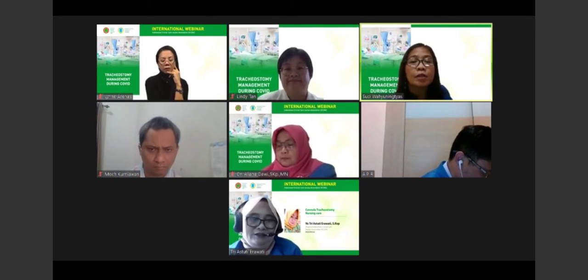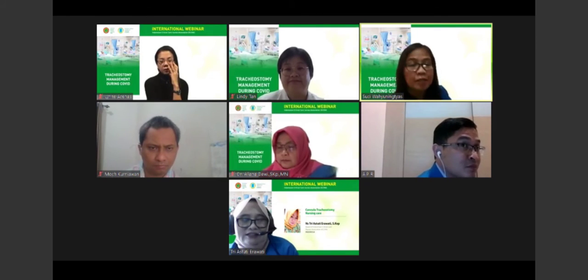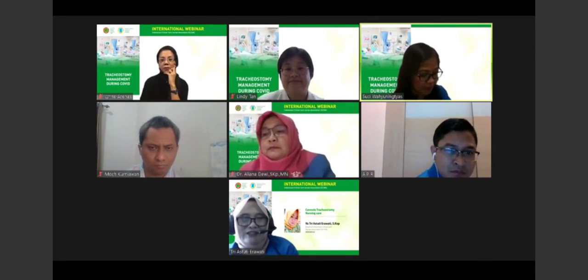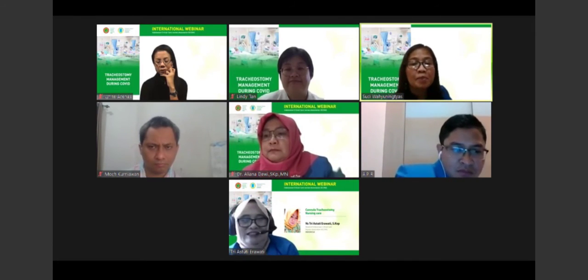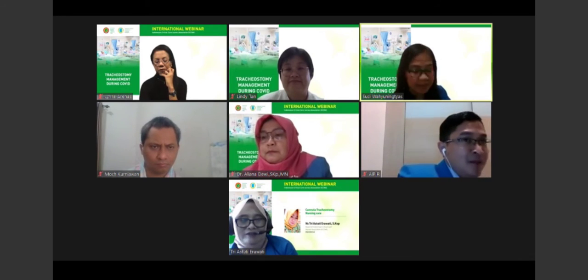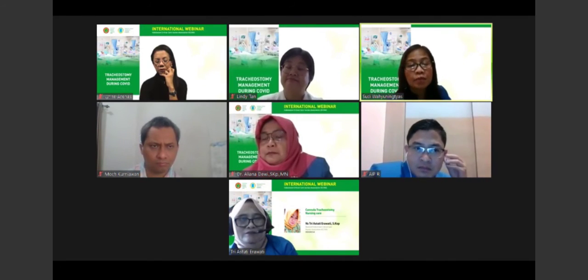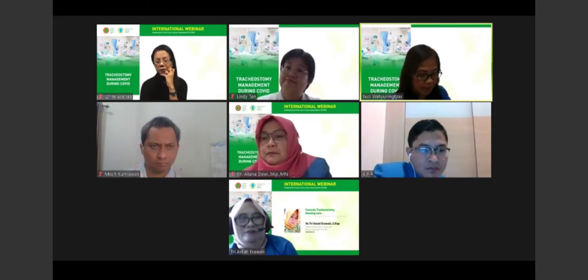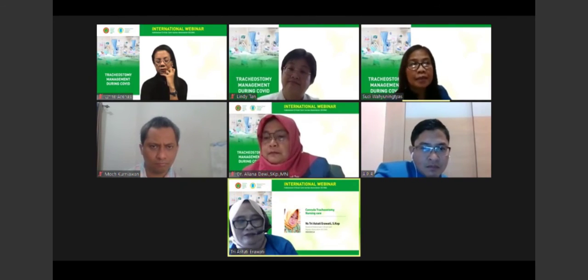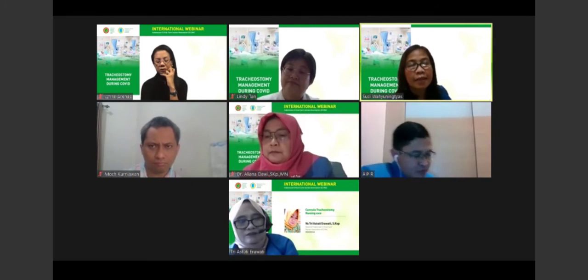Okay, thank you, Ibu Tuti, for the answer. Let me translate for Chocho from Vietnam. The answer from Ibu Tuti is that there is no recommended time for decannulation of the tracheostomy cannula. It depends on each hospital's standard operating procedure, which can differ.